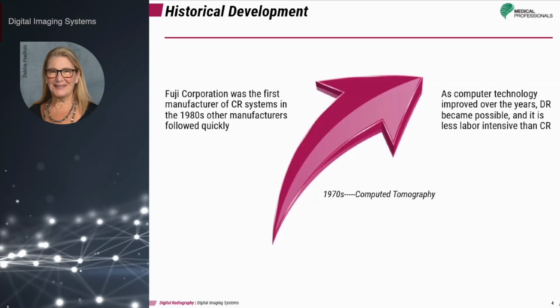And it was the first imaging modality to combine medical imaging technology with computer technology. MRI, ultrasound, and nuclear medicine continued this trend over the next decade.